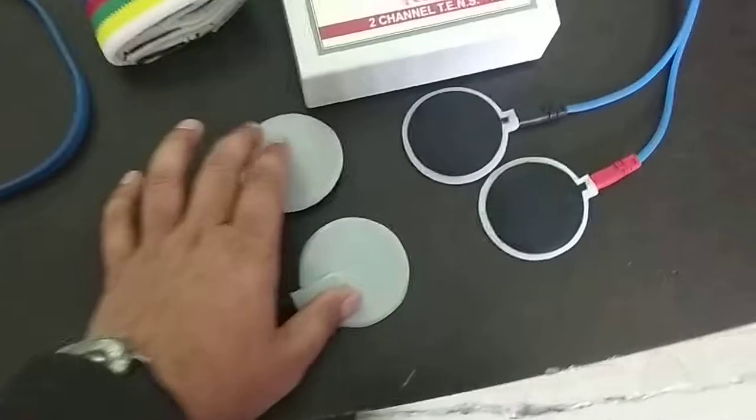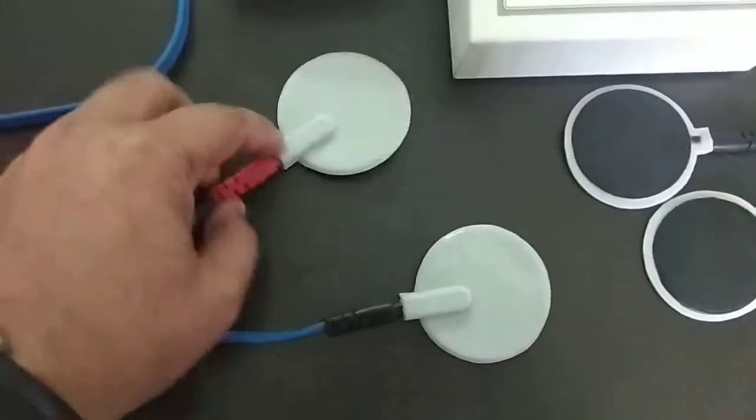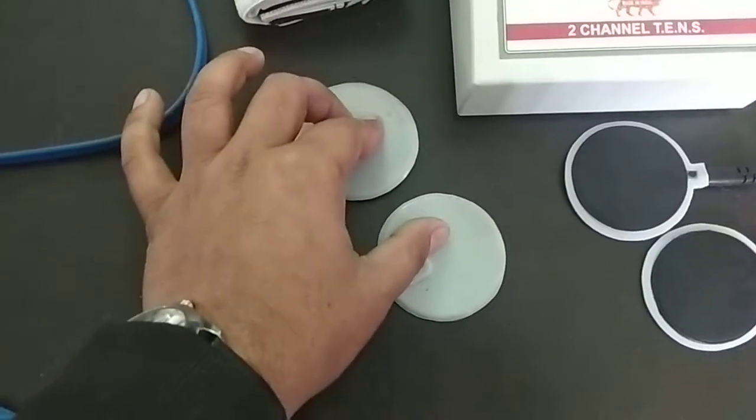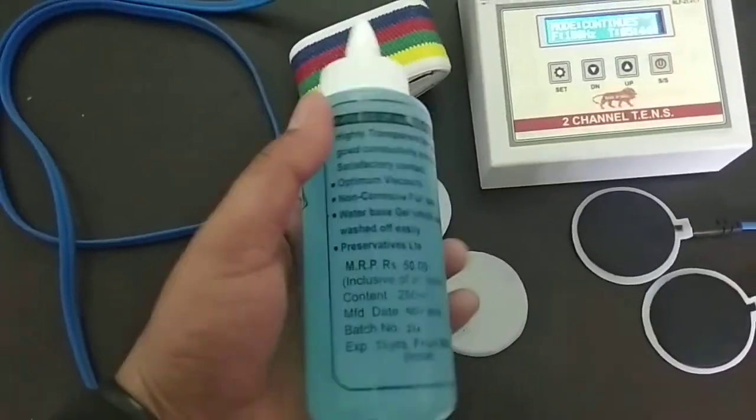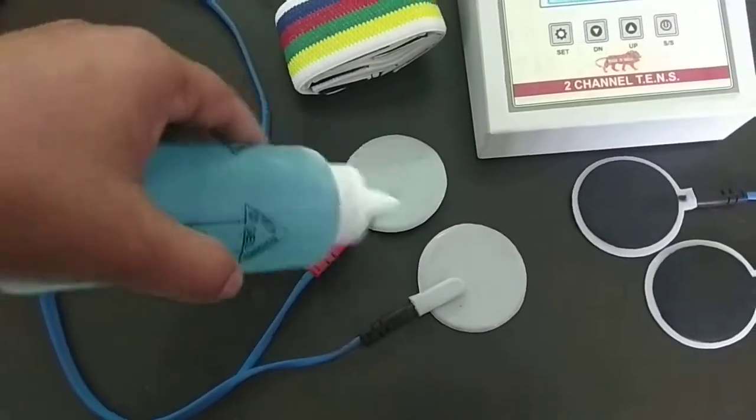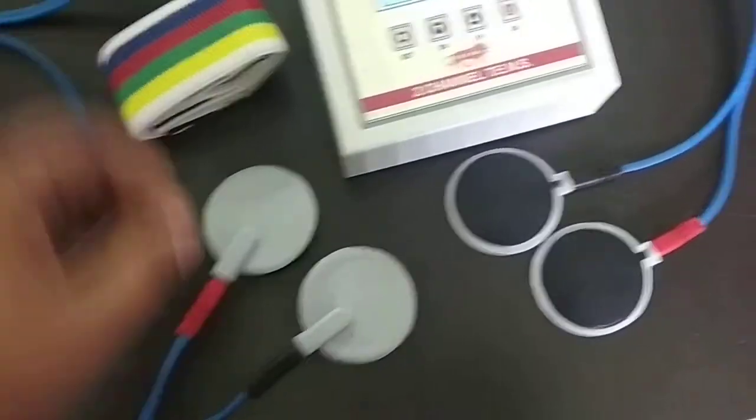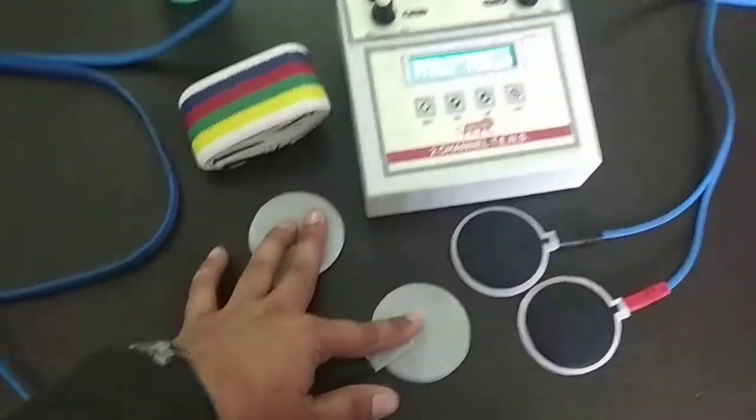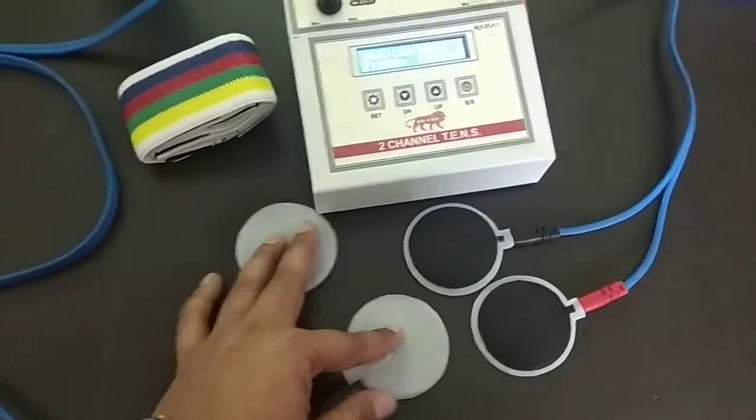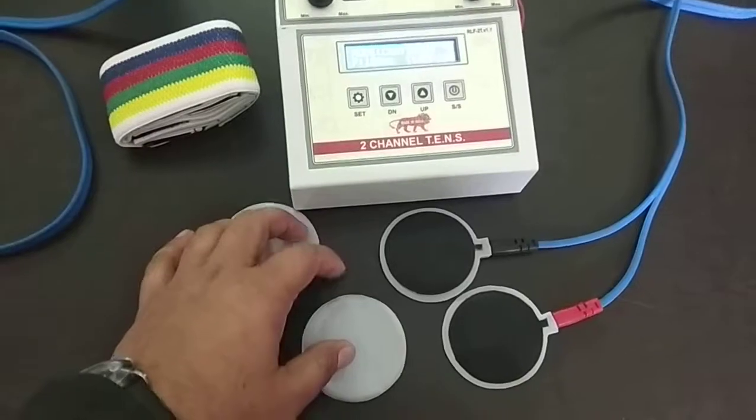You have to apply the pads on the treatment area like this, and before applying you have to apply gel also on skin. Then you can keep it like this. You can use this device in one channel or two channels also at a time.